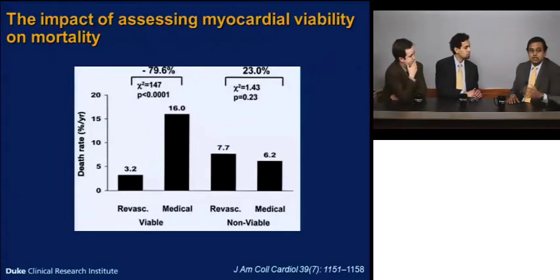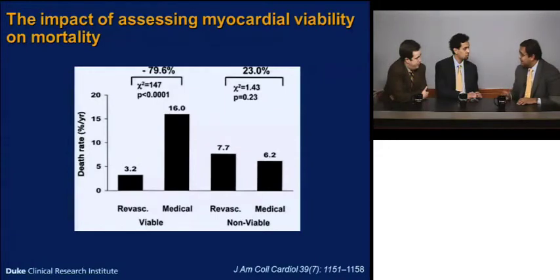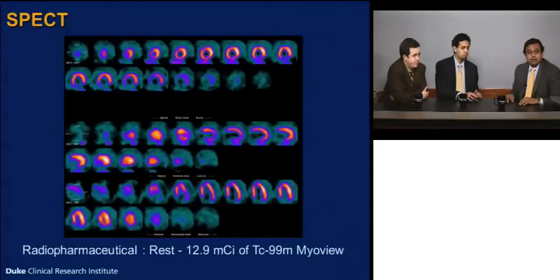Yeah, and I think, at least in viability, there are now starting to be some randomized trials. Rob Beanland in Canada, and others, are doing directed care with usual revascularization versus randomizing to a viability-directed revascularization. I think those are going to inform our practice because it's a strategy rather than the technology.